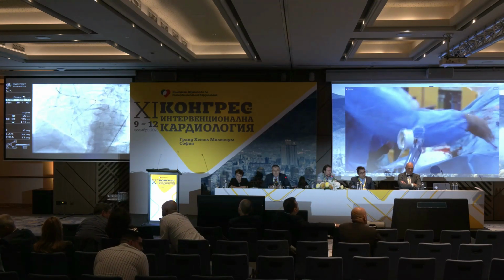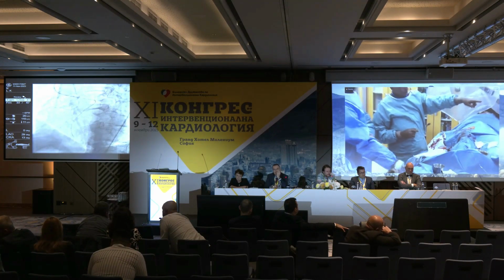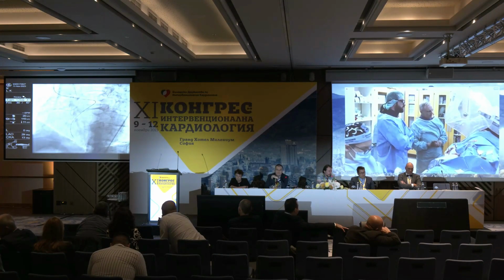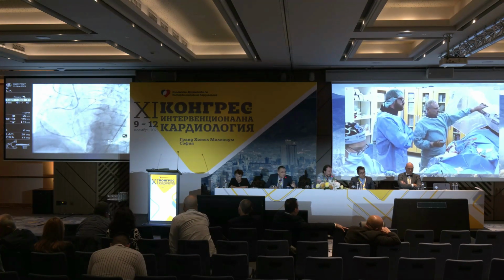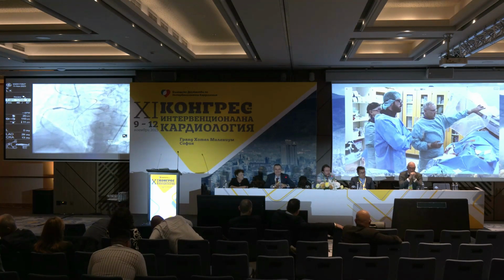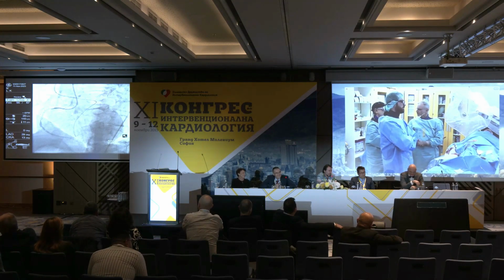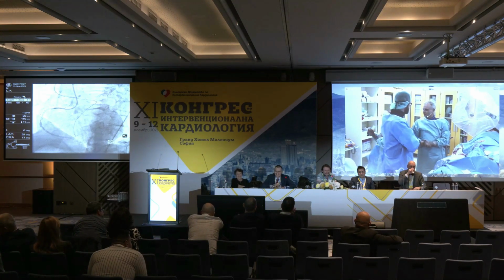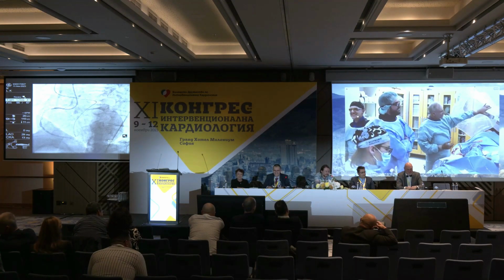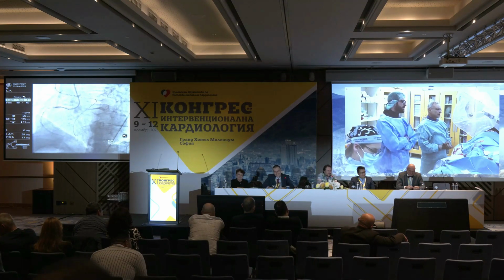So, Dr. Gelev, what do you think? We should start stenting from this part down there where there is this occlusion. You see, that's going to be our target. What about educational IVUS? Dr. Gelev, can we do education if you have a regular IVUS? Yes, that's a good comment, Dr. You understand me. Yes, we understand you, but it's very essential.